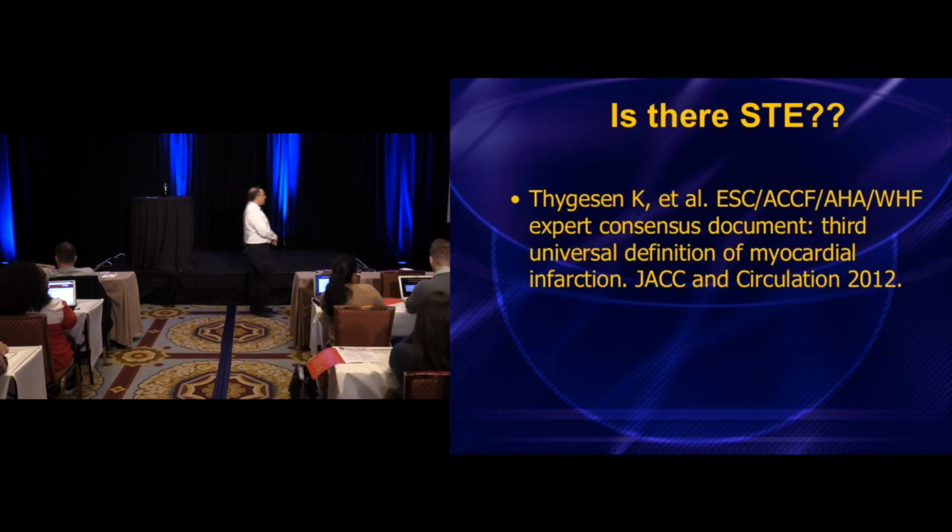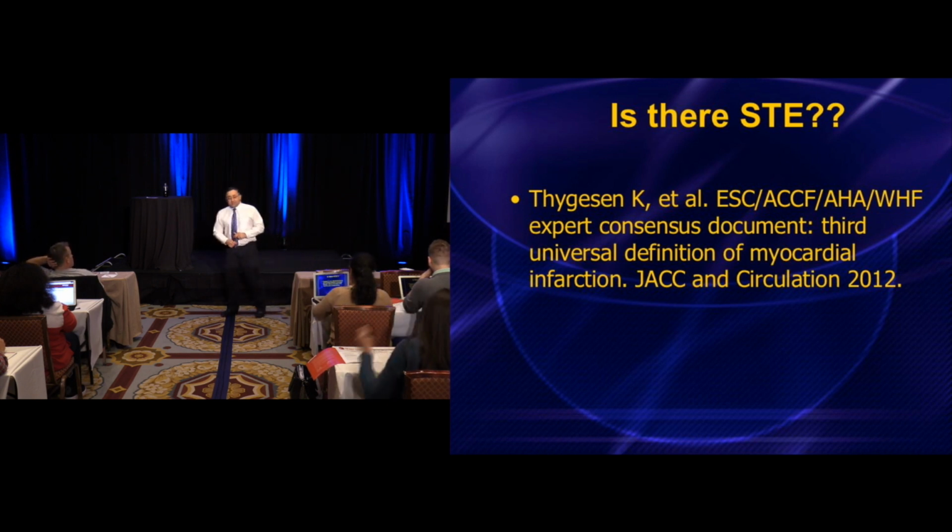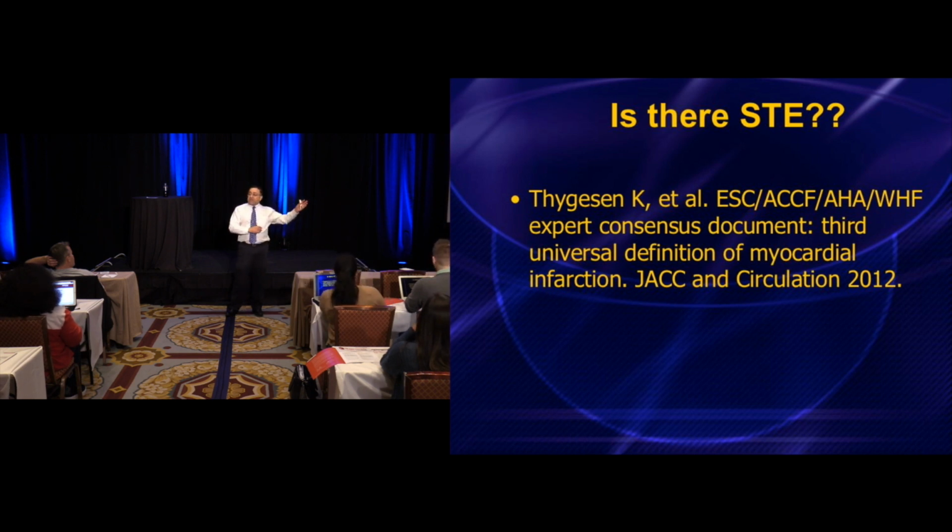All right? So let's take a look at what probably is the definitive article on how to diagnose STEMI on 12-lead ECG. This is the third universal definition of myocardial infarction. Every 5 or 6 years, the European Society of Cardiology, ESC, the American College of Cardiology Foundation, the American Heart Association, and the World Heart Federation get together and they publish the universal definition of myocardial infarction.